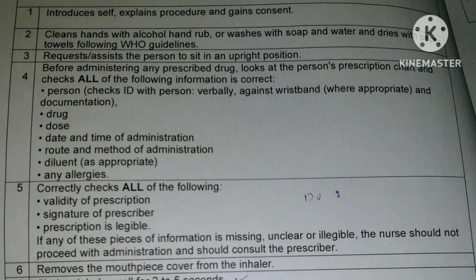We should verbalize that all this information is complete and it's a valid prescription, so I'm happy to proceed with the procedure. Then we should explain the procedure to the patient. Ask them, are they in a comfortable position for the procedure? Always make sure that they are ready. We already checked the prescription, it's complete, so we will start with the procedure.